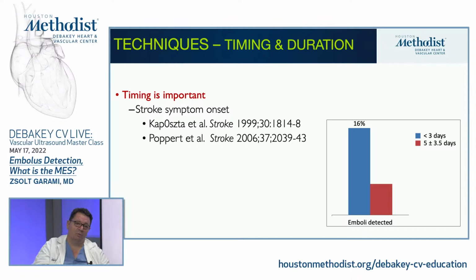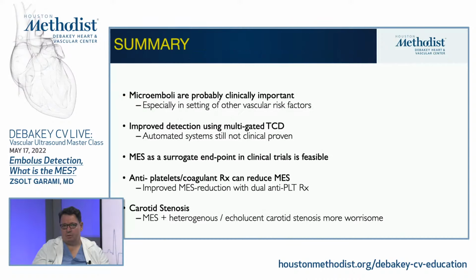And one more last slide for you, just to tell you that again, the timing is important. If you time it closer to a stroke, then you will definitely see more. If you are monitoring a week later, you're not going to see those microembolus signatures. Those may have been responsible for generating the symptoms, or may be part of the still-lying clot source for those microembolus signatures.